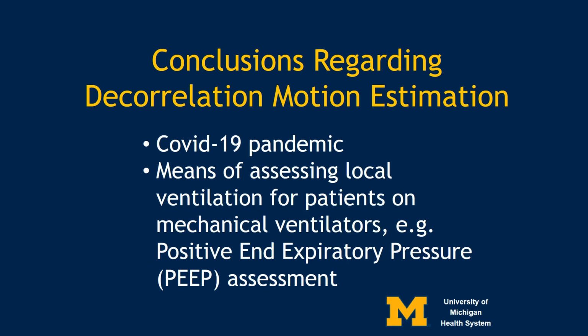One potential application for this metric would be to evaluate ventilator performance during the present COVID-19 pandemic. This would be particularly useful in circumstances where a ventilator is being shared between two patients. The use would be to monitor positive end expiratory pressure, or PEEP, in each patient.